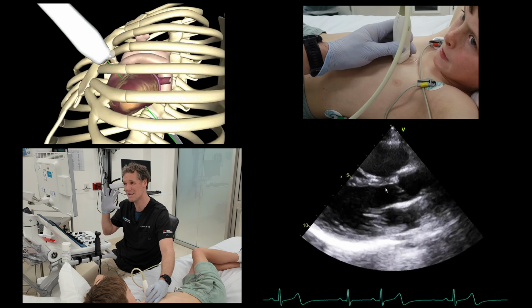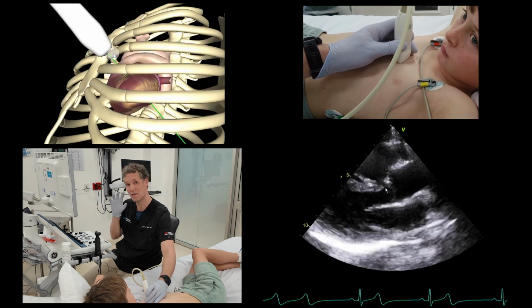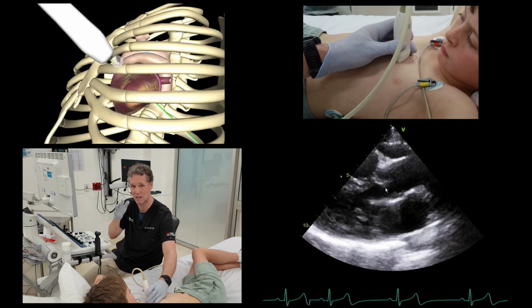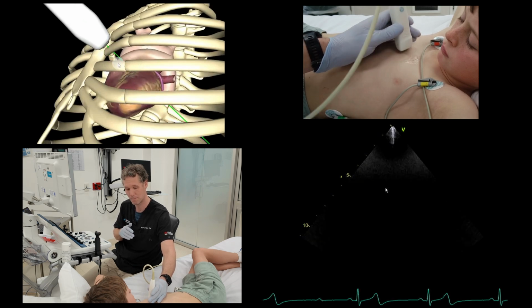can you see that the image just looks a little brighter and a little crisper? And that's just nestling into that intercostal space, improving the contact, helping those sound waves come from the echo probe into the patient. Okay?